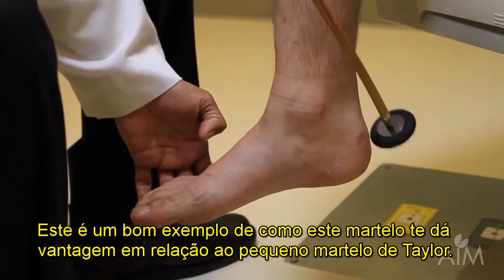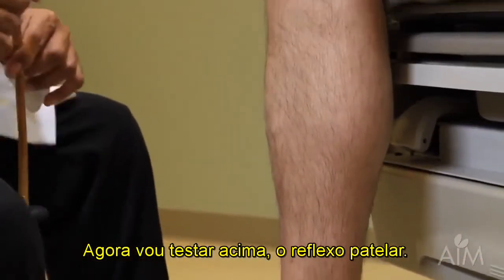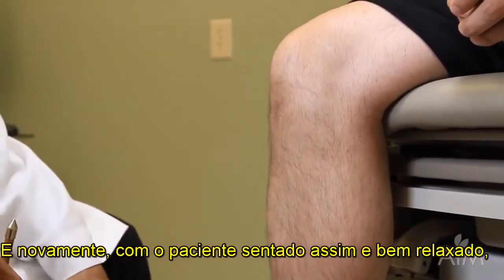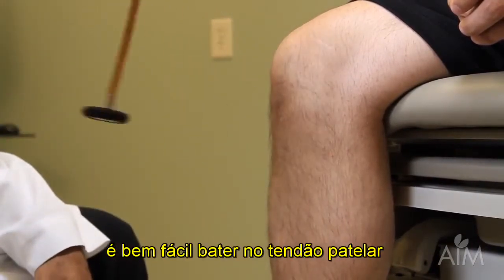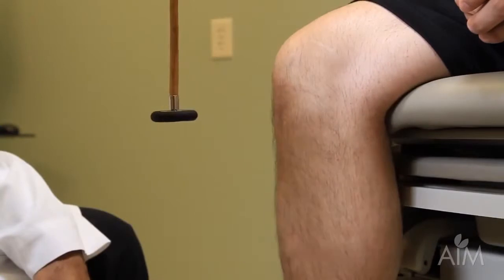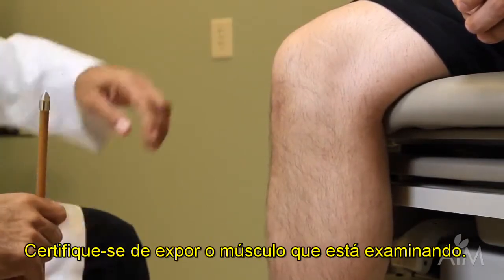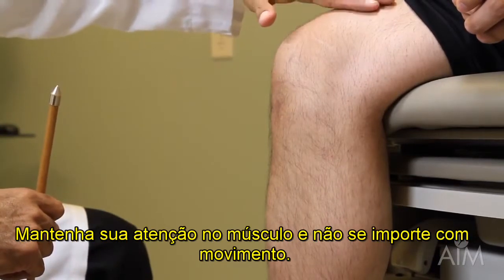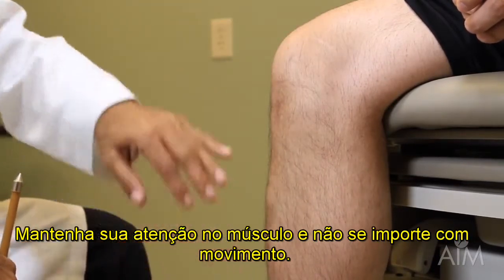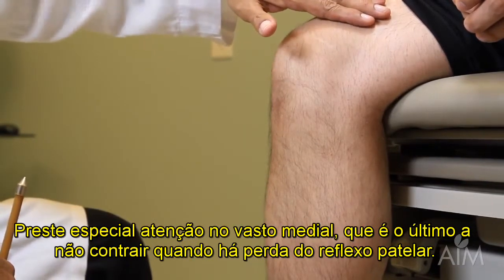This is a great example of how this hammer gives you a great advantage over a little Taylor hammer. I'm now going to move up to the knee reflex, and again with the patient sitting like this and very relaxed, it's quite easy to hit the patellar tendon and notice a nice brisk contraction of the quadriceps muscle. Again, be sure to expose the muscle you're looking at. Keep your eyes glued on the muscle. Don't worry about the movement, especially the vastus medialis, which is the last thing to go when you lose the knee reflex.